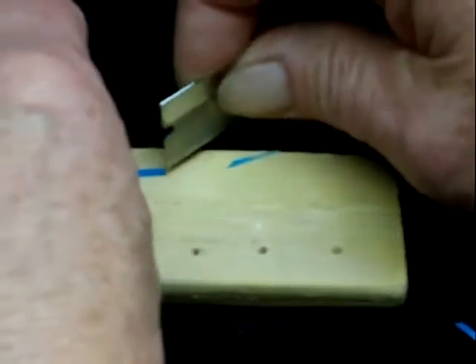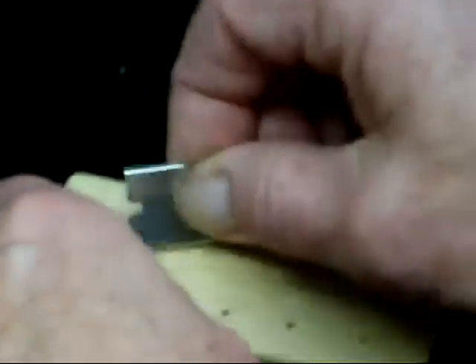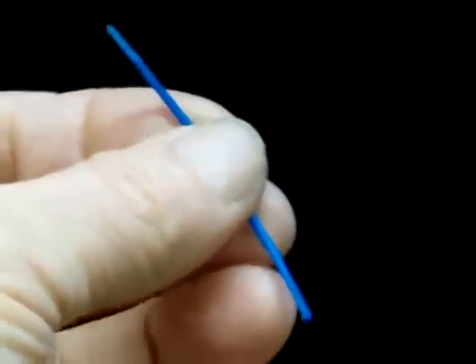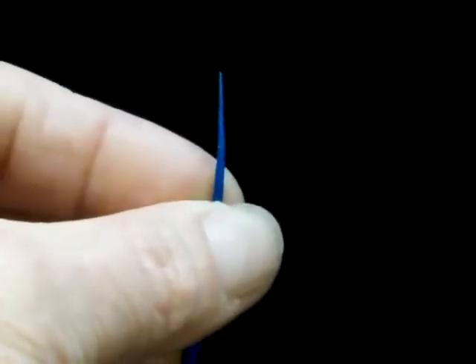Each automatically has a gradual firmness transition and, being an integral part of the core material, is more rugged than any whisker attached to a core. It may eventually wear down, but it will never break off. One brush lasts practically forever. I have used this one twice a day for a year.